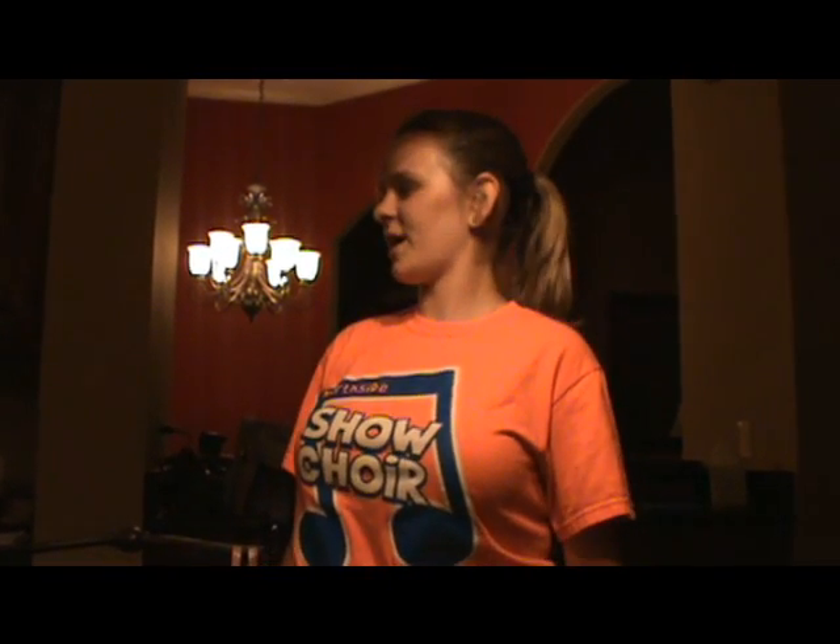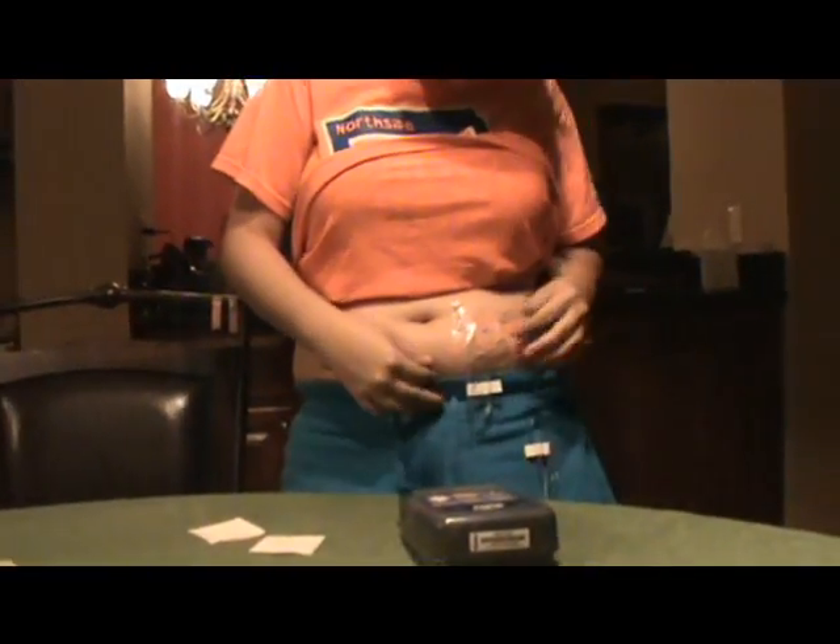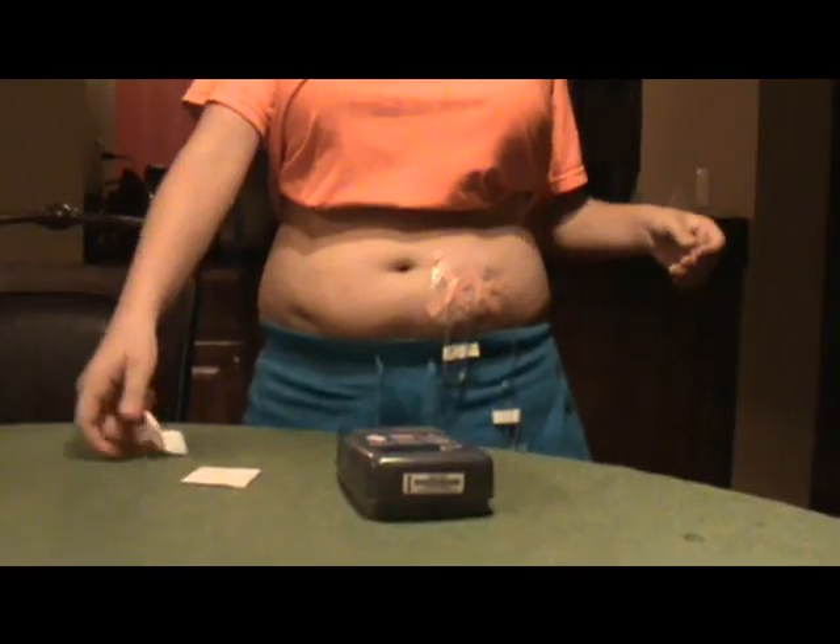Hi, it's been an hour since I was so stuck, so I'm now done and I'm going to take out my needles. As you can see, they're exactly where I left them. Normally you can use band-aids, but today I'm using a 4x4 which I can fold up into a tiny little 2x2 square. And I have a little piece of tape that I'm going to use as a makeshift band-aid.